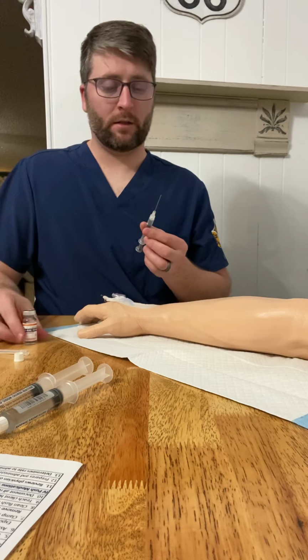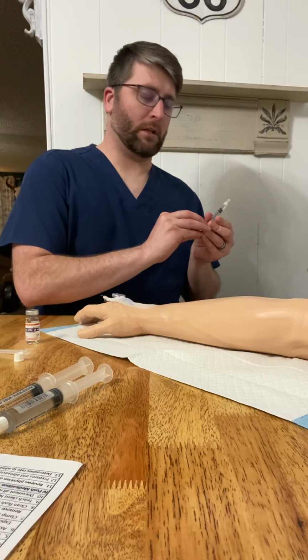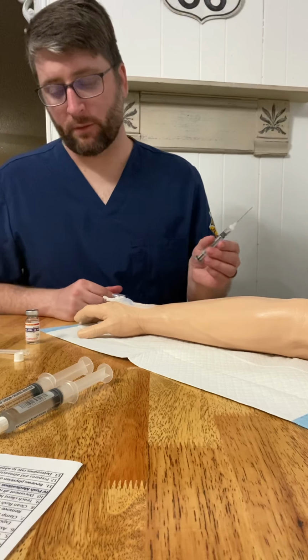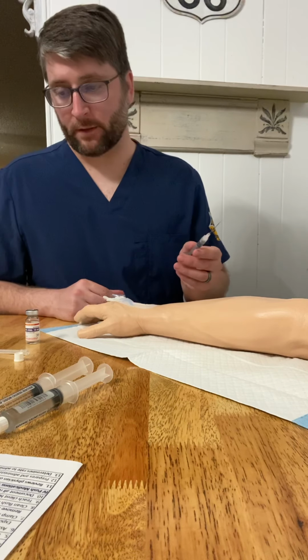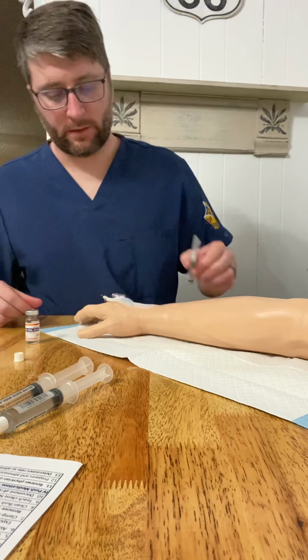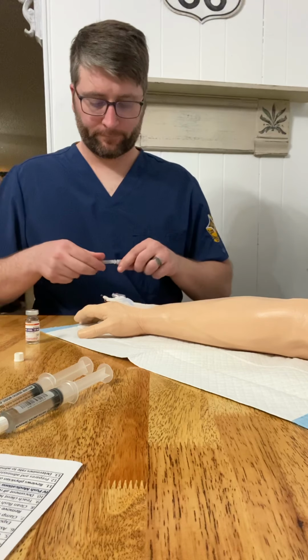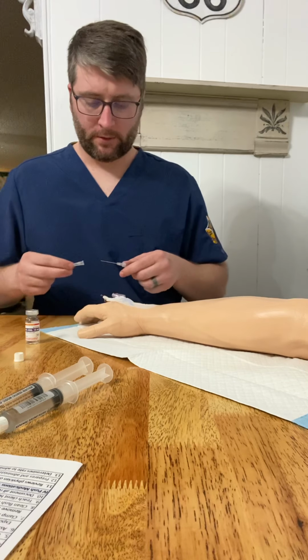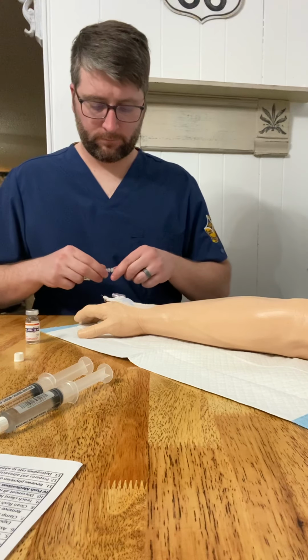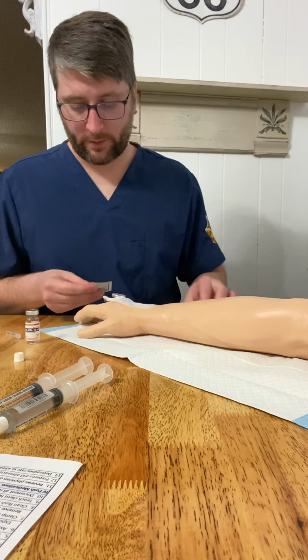All right, we're going to knock our air out. Still 1 milliliter. So at this time, we're going to put that in the scoop there. So we still got our 1 milliliter.